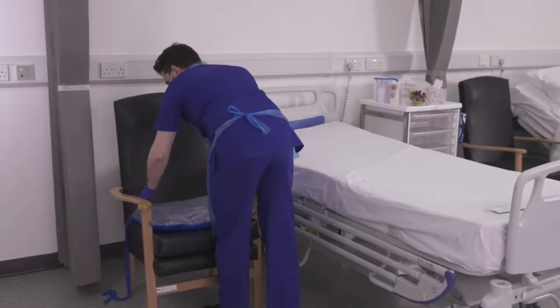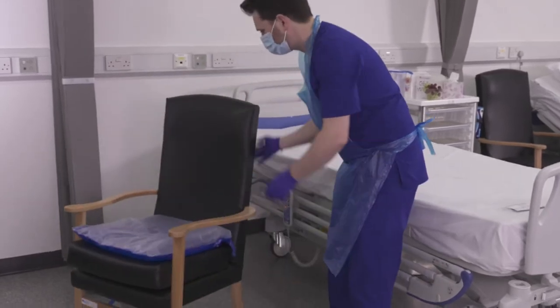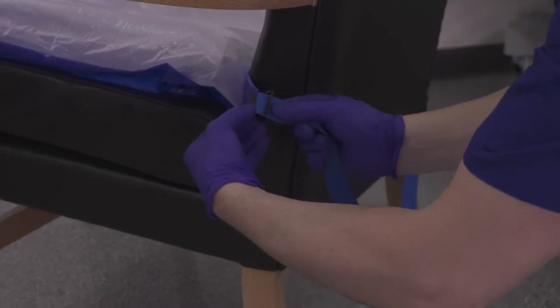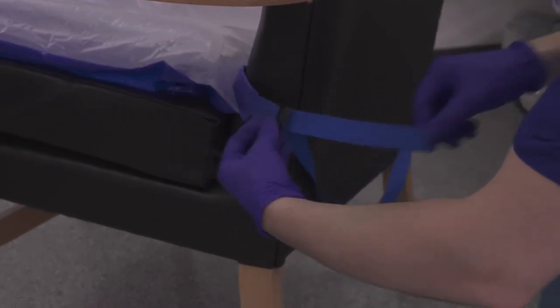Check Repose regularly and top up within a period of no longer than 14 days using the pump supplied. Install Repose with the valve facing down and away from the patient. Secure in place with the integrated retaining straps, and use the securing strap around the back of the chair.